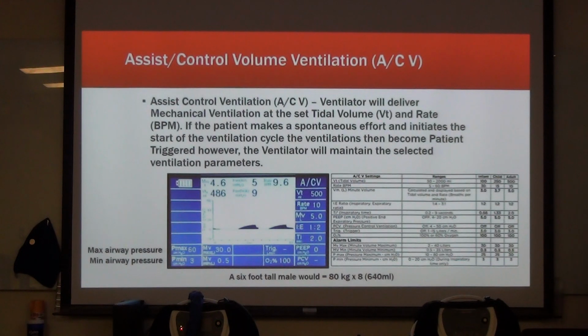So there you go. Sometimes you have to gauge that and see, if I'm making a change, is it better for me to give them volume rather than rate? Because rate, think about this, takes us back to our whole dead airspace issues, right? Increasing rate increases what? Dead airspace time, right? So you have a factor that you have to deal with. So volume sometimes is better than changing rate, though you can change rate.